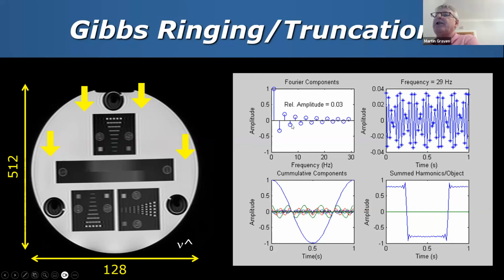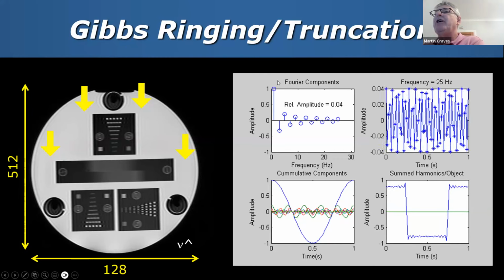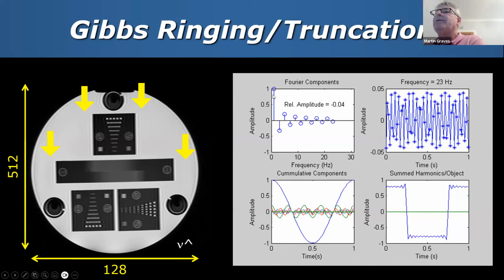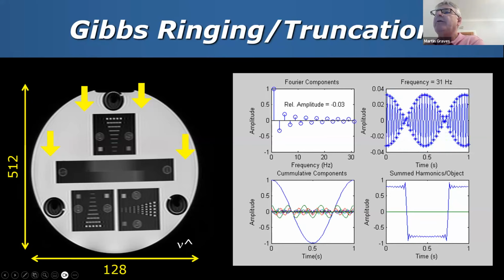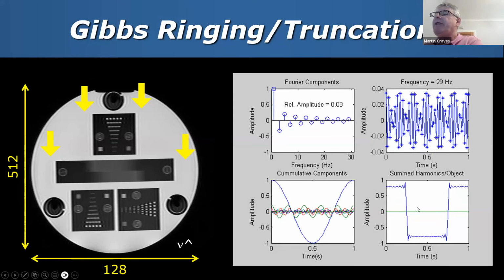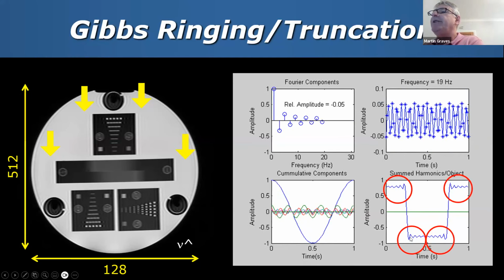And this arises essentially because if we try to capture a very sharp edge, such as I'm doing here, what this movie is showing you is the necessary sines and cosines, the Fourier components that make up a square wave. So as we add more and more odd harmonics of these particular amplitudes, here I'm just drawing them all together and showing you each one of them. When you put them together, you can see we can actually synthesize a square wave. However, things are not perfect, and we can see that we get these fluctuations near the sharp edges of the square wave.